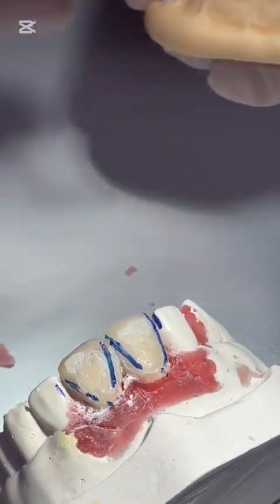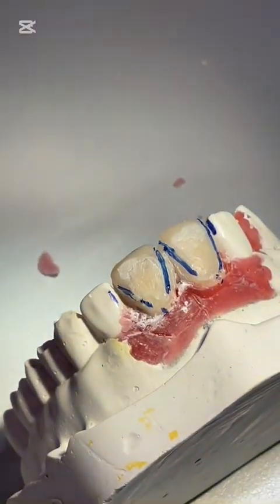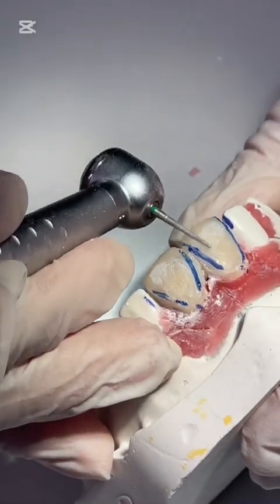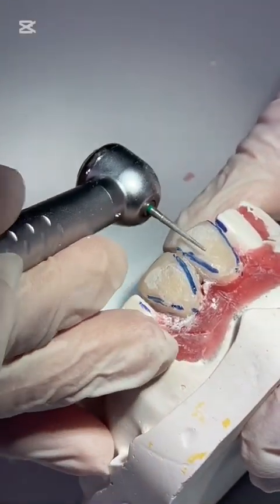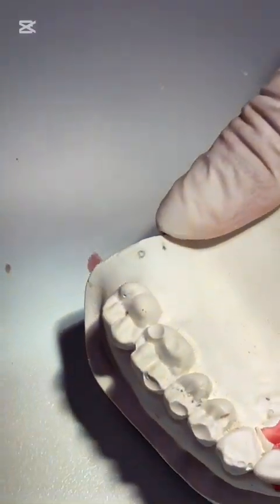Now I will remove the previous composite. Usually I should be able to remove it.